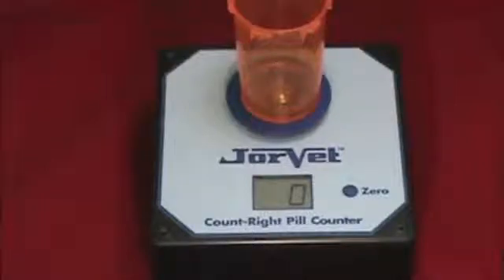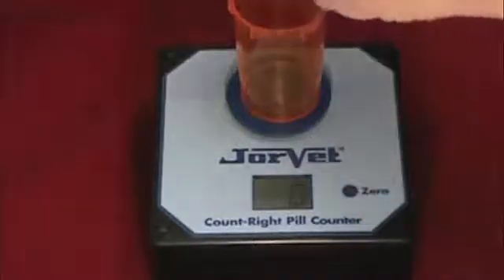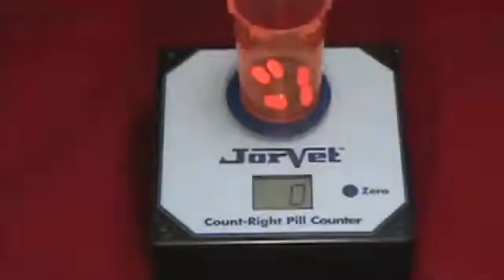Add five pills at one time. The simplest way to do this is by pouring five pills onto the vial cap while the counter is zeroing, then dumping them in the vial when the display shows a steady zero.